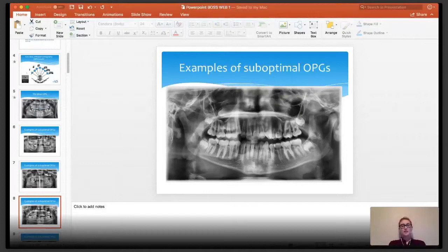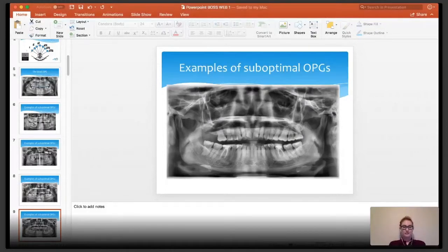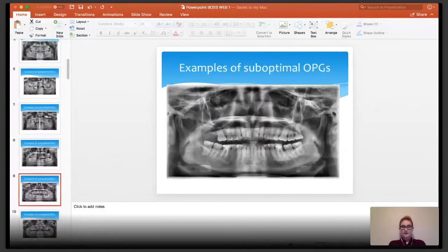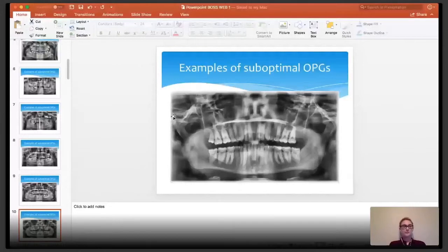When the patient is a little chin high and the tongue isn't to the roof of the mouth, you get a big air gap over the anteriors and start to lose the image. It's important to have that tongue flat against the hard palate. For head positioning, you're trying to line up the inferior orbital margin with the external auditory meatus — that line should be parallel to the floor, giving you a nice smiley OPG with a slight curve on it.